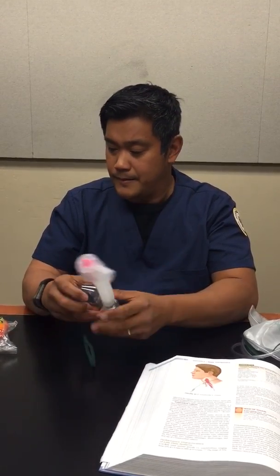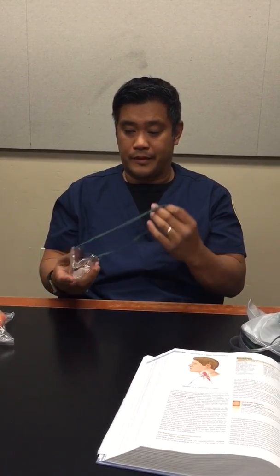So we've got that, and to place this on is similar to other kinds of masks. Chin, strap over the head behind the ears and adjust, and you can also pinch the collar of the nose.